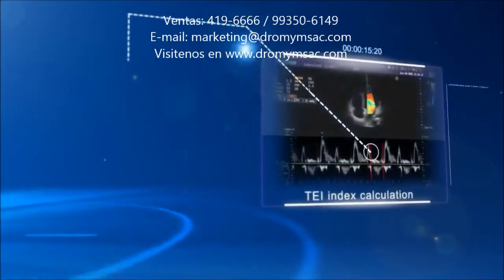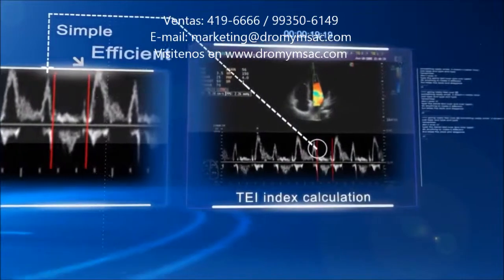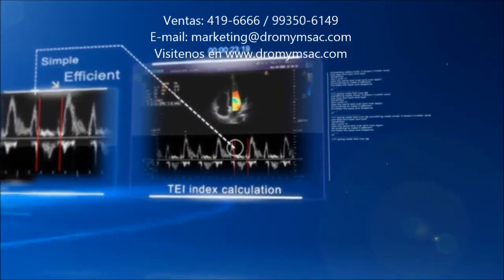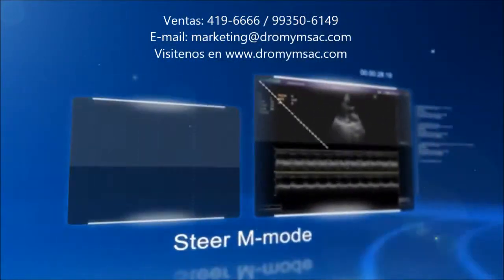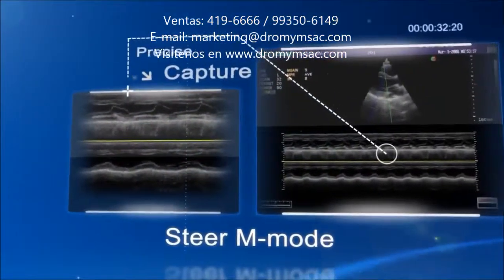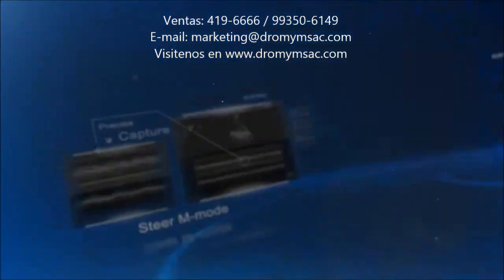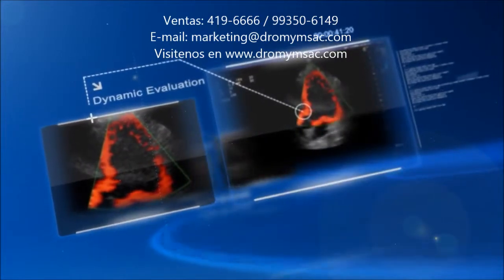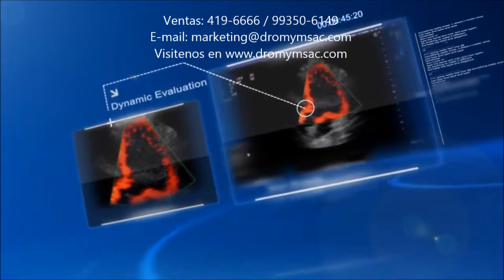S20's Cardiac Package offers powerful calculations for cardiopathy diagnosis. The TEI Index provides a simple, non-invasive, and reproducible way to evaluate cardiac diastolic function independent of ventricular geometry or valve regurgitation. In Sonoscape's STEER M mode, three adjustable sampling lines can be dragged and anchored to any position to precisely capture myocardial movement. Tissue Doppler Imaging visualizes myocardial contraction and calculates the velocity of cardiac tissues.